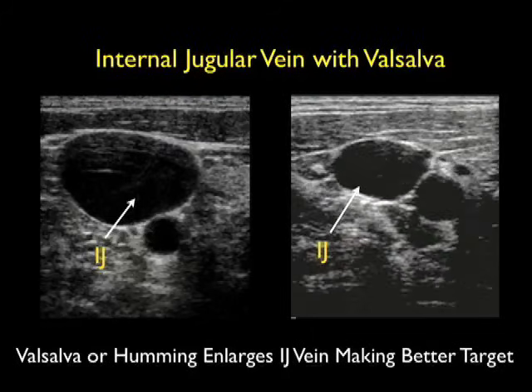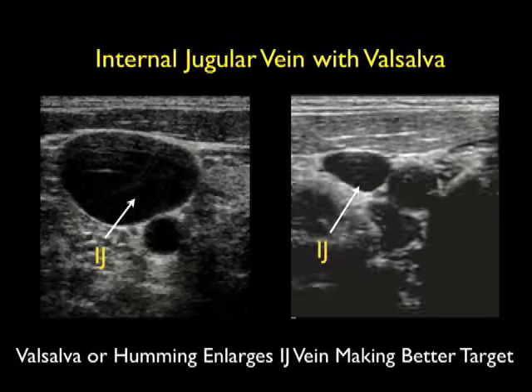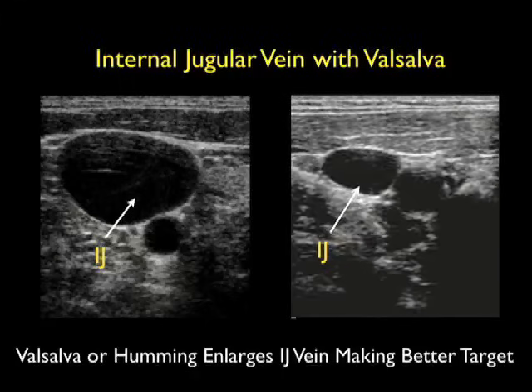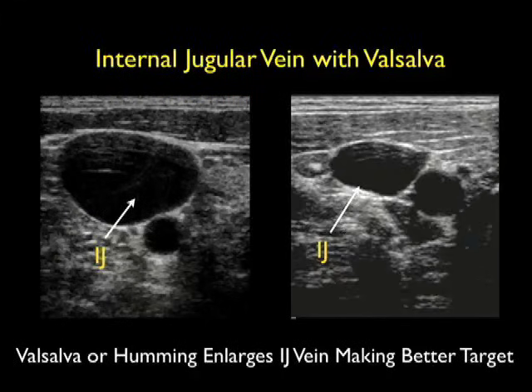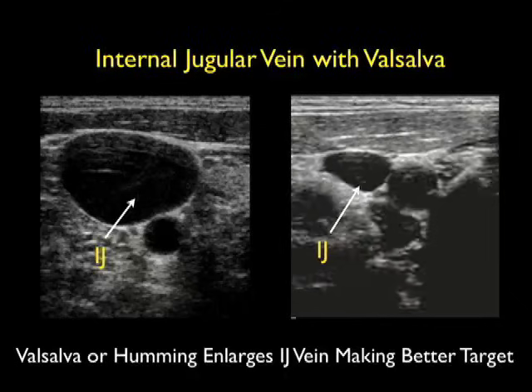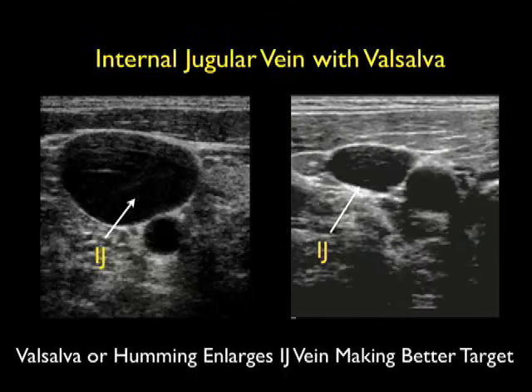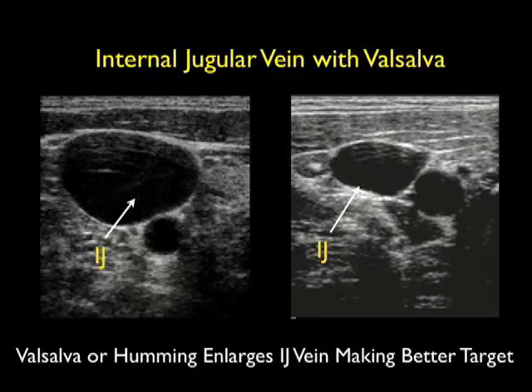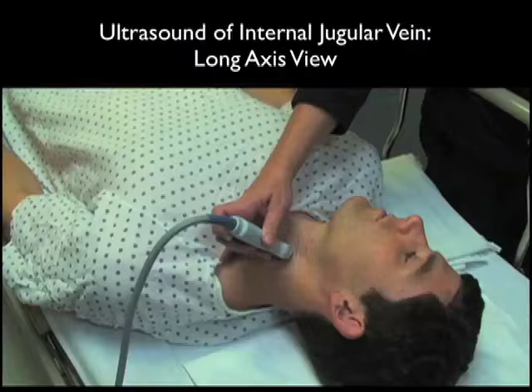In the image to the right, note the relatively small caliber of the internal jugular vein — it's almost as big as the carotid artery — but it becomes much more distended as the patient bears down. Using the Valsalva technique can make it a much better target for placement of the large cannulation needle.